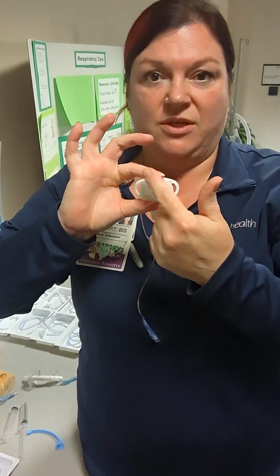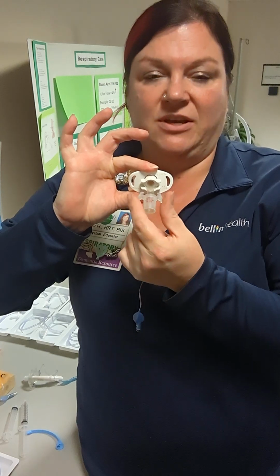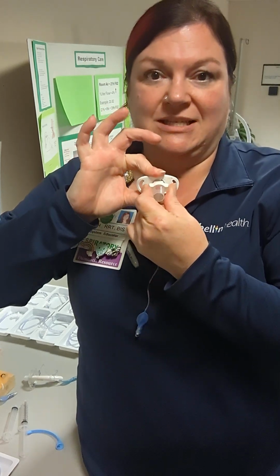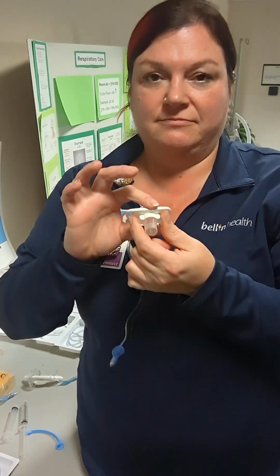I like to brace my trach flanges with my opposite hand when I use this kind specifically, because then I can push against myself instead of pushing into their neck. Okay.